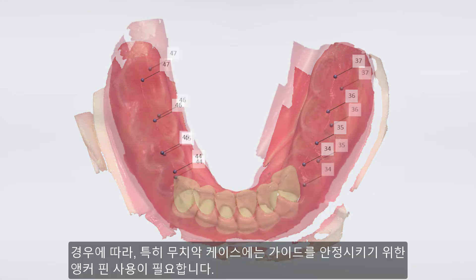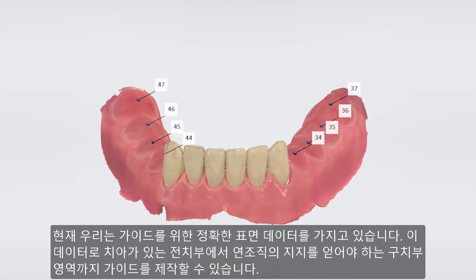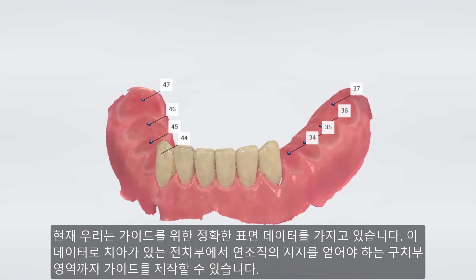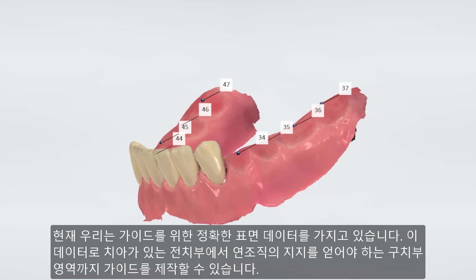In some cases, and especially for edentulous cases, we need to use anchor pins in order to stabilize the guide. Now we have a good, accurate surface to initially insert the guide on, starting on the front teeth and changing to tissue support in the posterior areas.